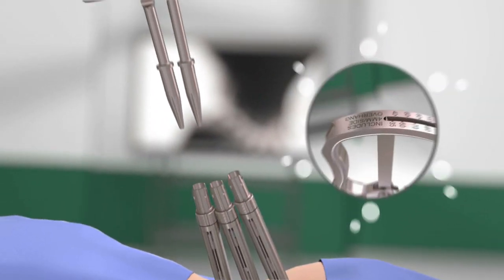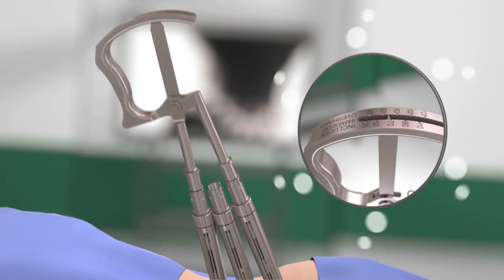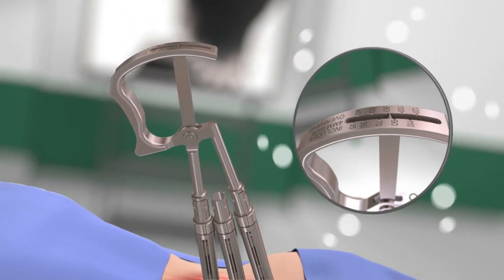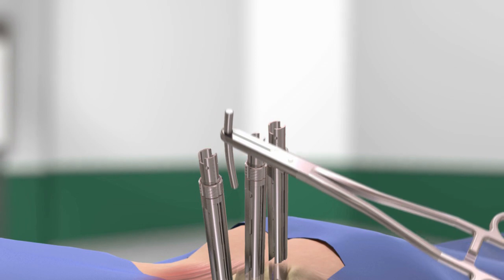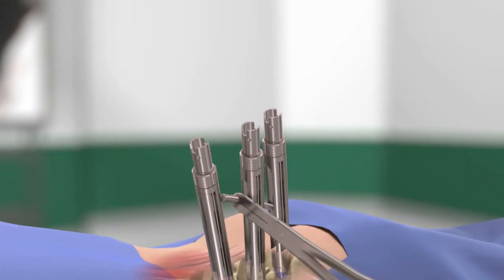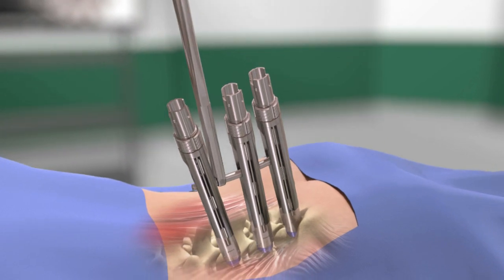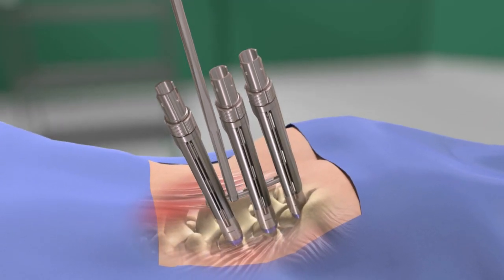Once tissue dissection has occurred, insert the rod measuring tool to determine the correct rod length. After the appropriate rod length has been determined, place the rod with the rod holder. Advance the rod until seated into the head of all pedicle screws.